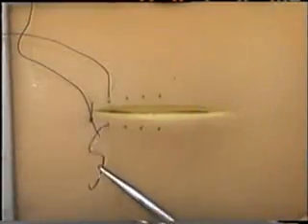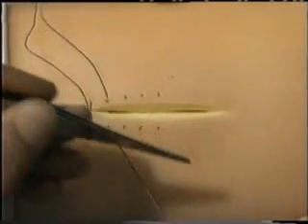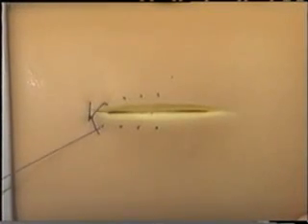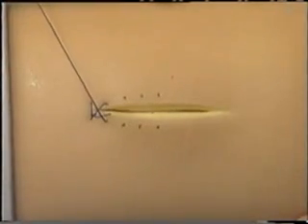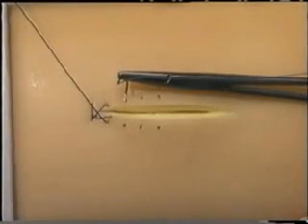Therefore, when dealing with a long thread, don't simply pull at the needle, but use the middle finger of your right hand to grasp the thread, and then use your closed forceps to take up further slack. Suture material can then be tightened without the needle leaving your field of vision. Your suture material is then passed to your assistant, and the needle is now available for your next suture.